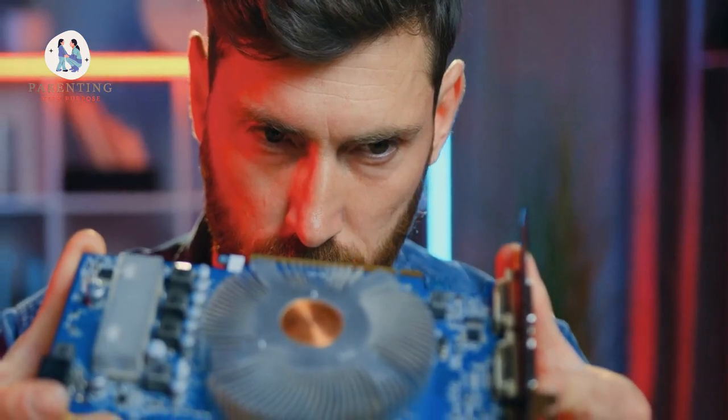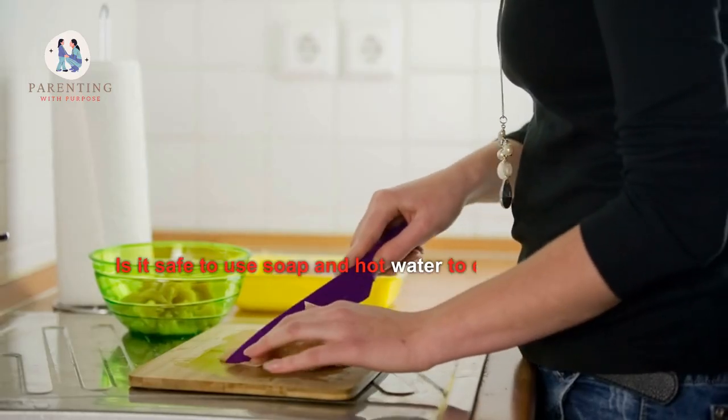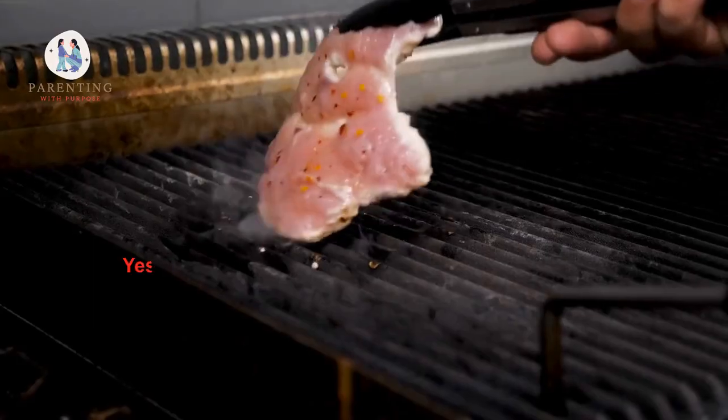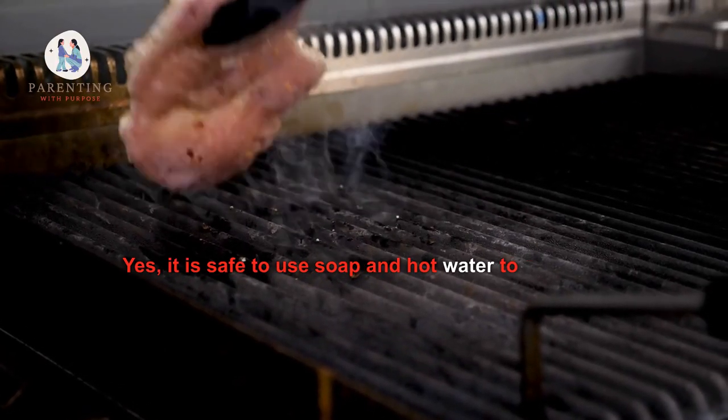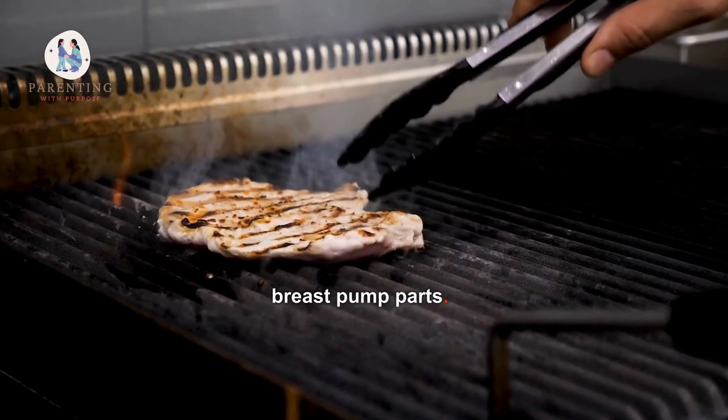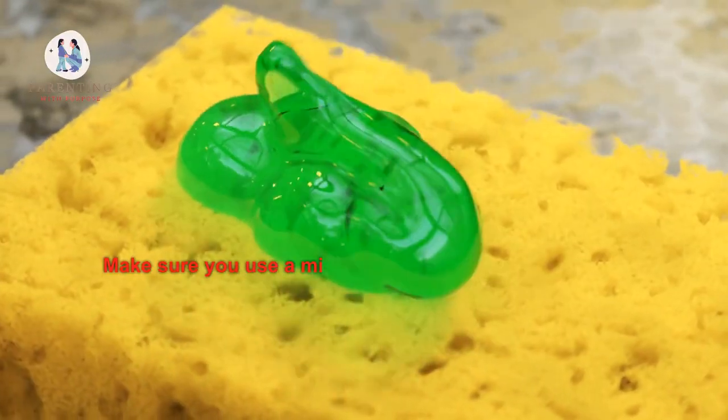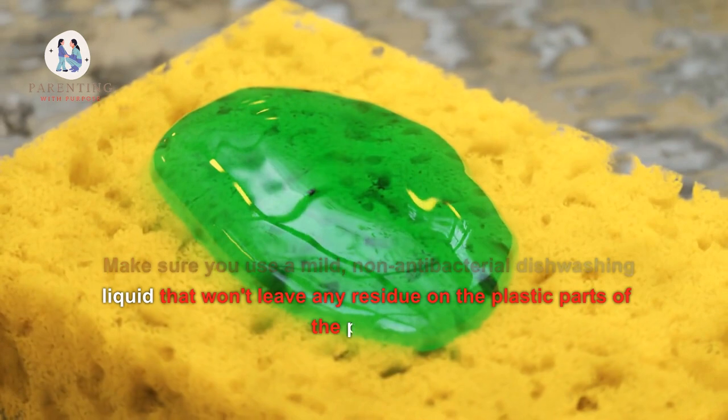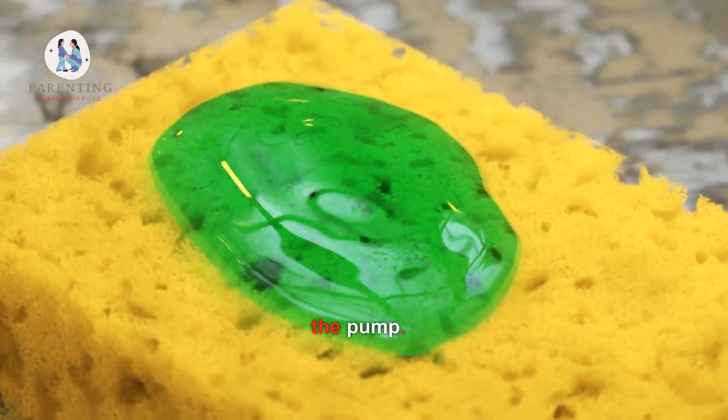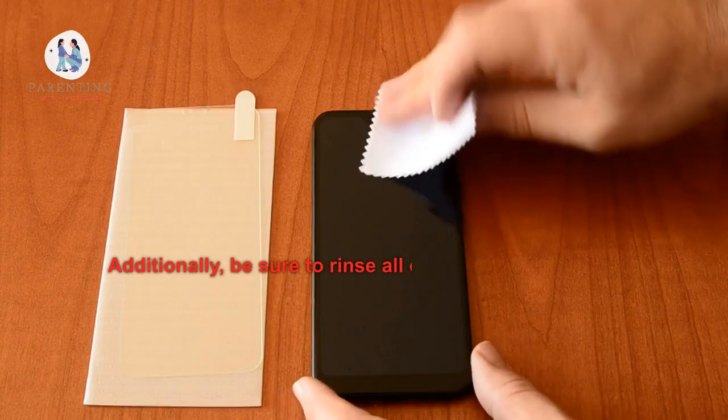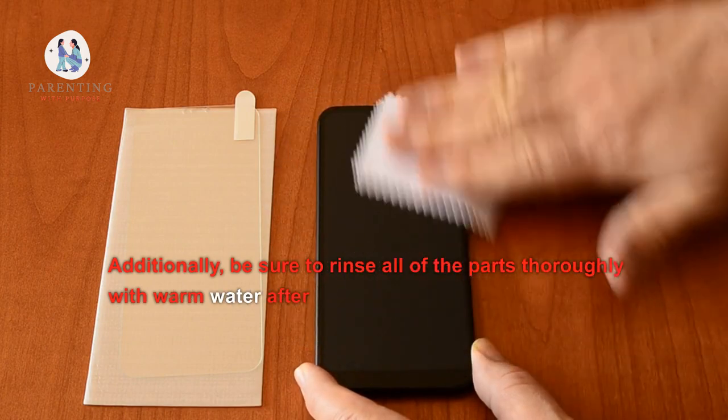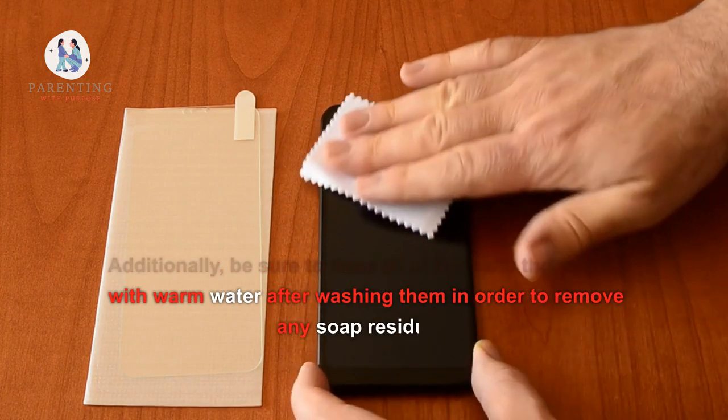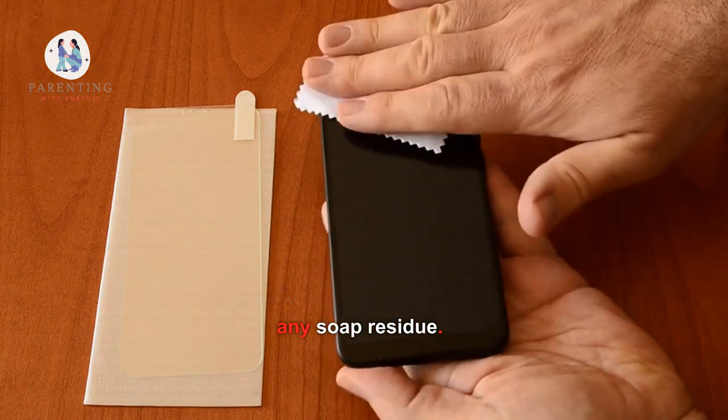3. Is it safe to use soap and hot water to clean the breast pump parts? Yes, it is safe to use soap and hot water to clean the breast pump parts. Make sure you use a mild, non-antibacterial dishwashing liquid that won't leave any residue on the plastic parts of the pump. Additionally, be sure to rinse all of the parts thoroughly with warm water after washing them in order to remove any soap residue.